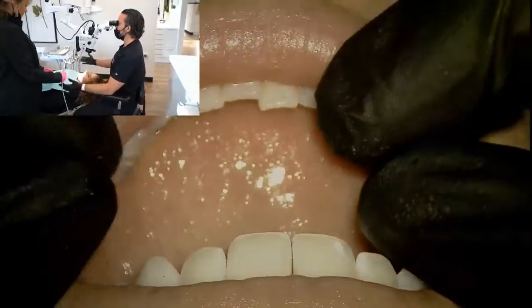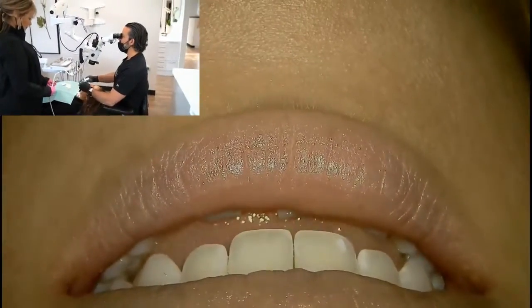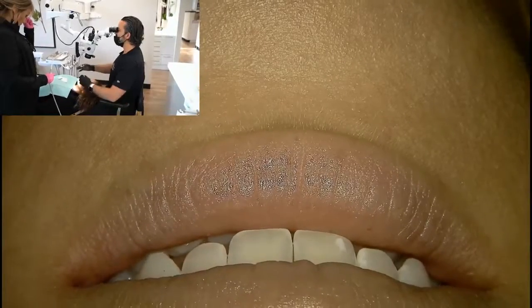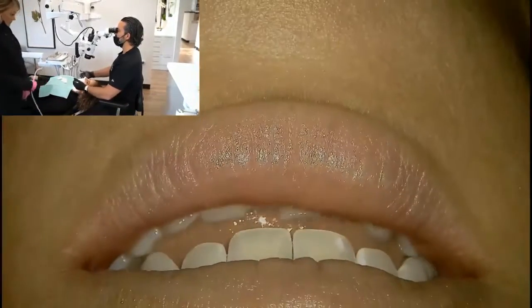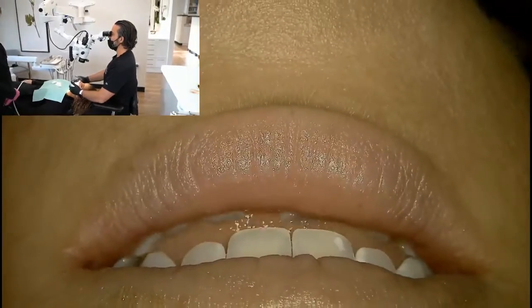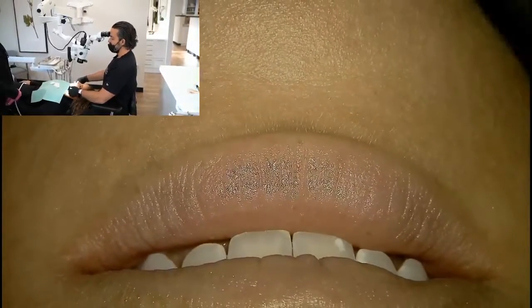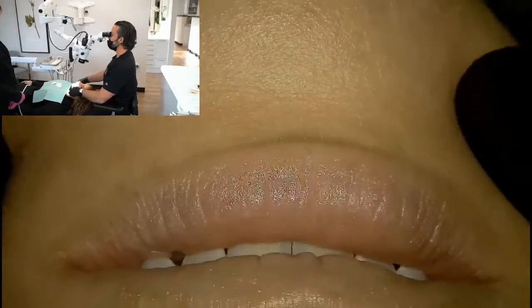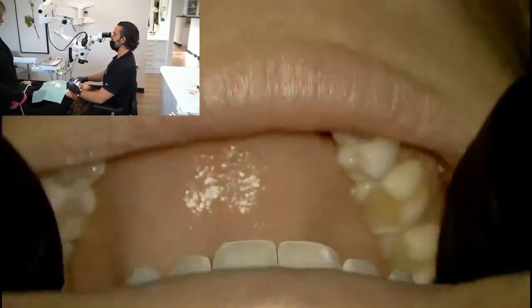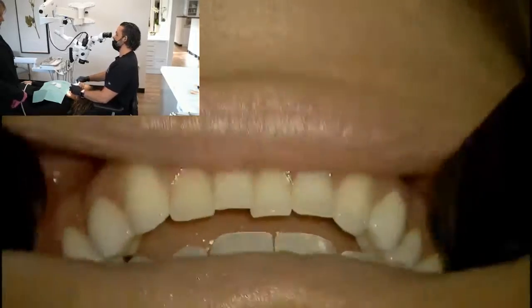So this is how I work. There's always that wasted movement in space, but when I'm like this, things are always in focus. I'm in control. If a patient is swallowing or moving, I have access to the chin open wide. Very easy to work around.